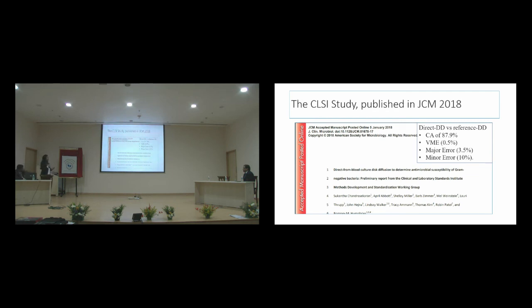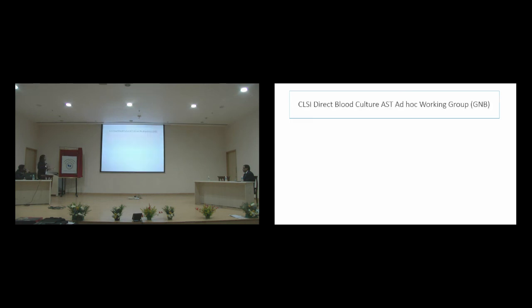Here the results of this test are: categorical agreement was 87.9%, very major error was 0.5%, major error was 3.5%, and minor error was 10%. This present study was done mainly on gram-negative isolates, and they have said that this is an acceptable error. This can be safely implemented in the clinical laboratory.